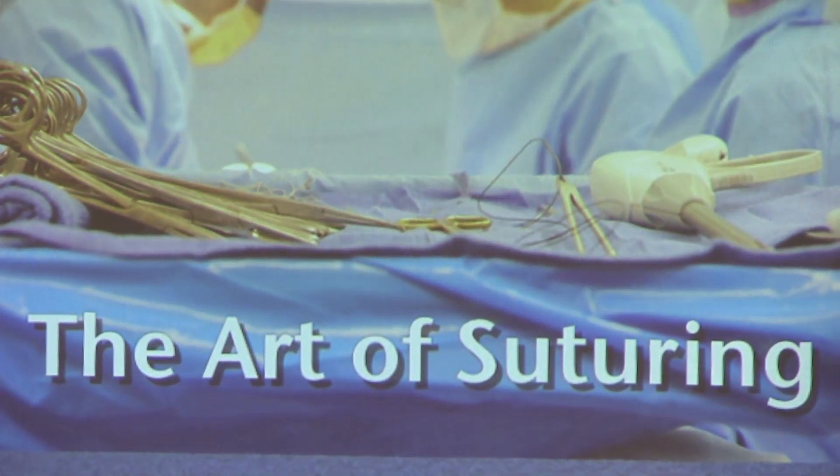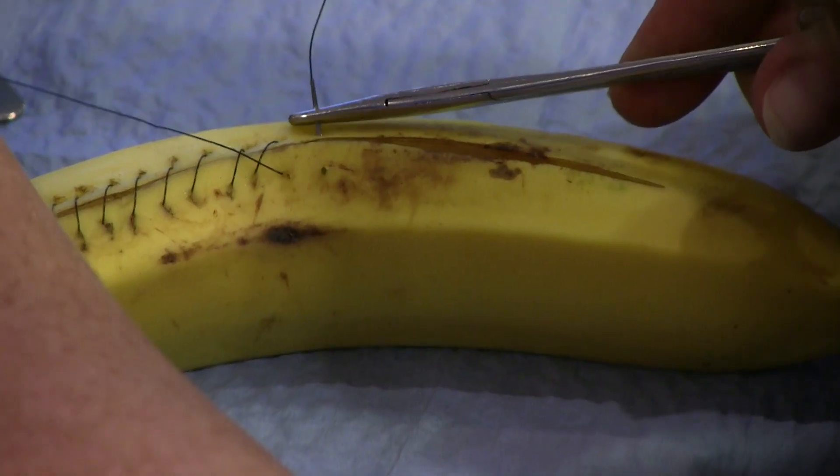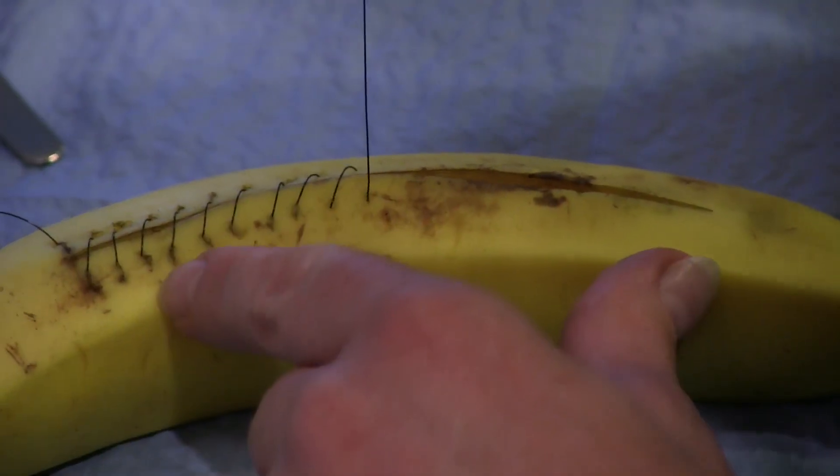This is Umut Zarpel, a surgeon in New York who taught the art of suturing class at the Brooklyn Brainery. So no, I did not make this up. Umut is going to teach us how to suture by having us practice on bananas to simulate skin, just like they do in med school.